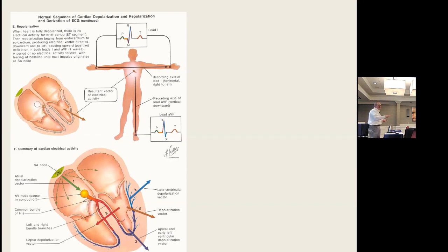Because if it doesn't, and tomorrow you'll learn about QT prolongation and all the drugs that cause it, because if the QT prolongs enough, you get a phenomenon of R on T, and all of a sudden you're depolarizing while you're repolarizing, and you've got a problem on your hands. So QT prolongation is something that's very real and something we all monitor EKGs for, and we're going to have a few cases on that.